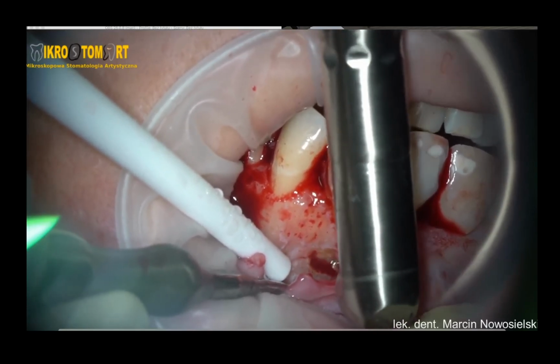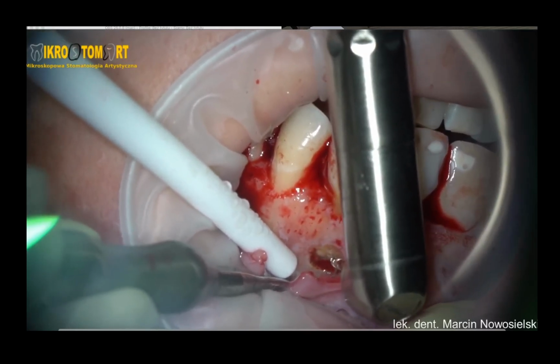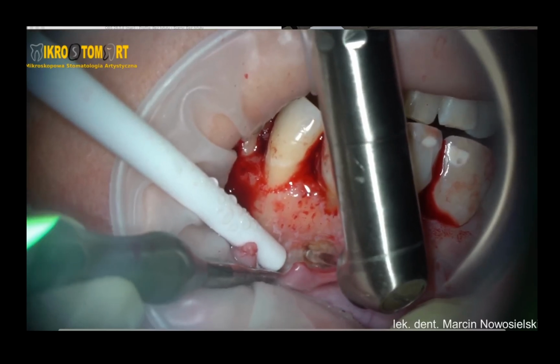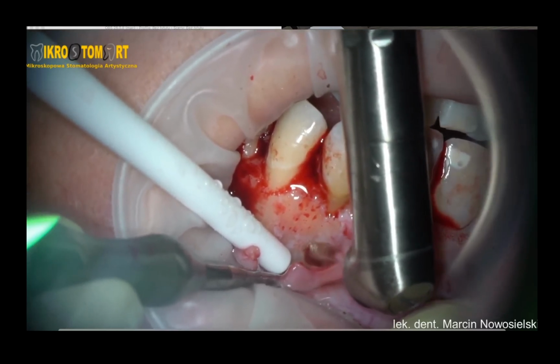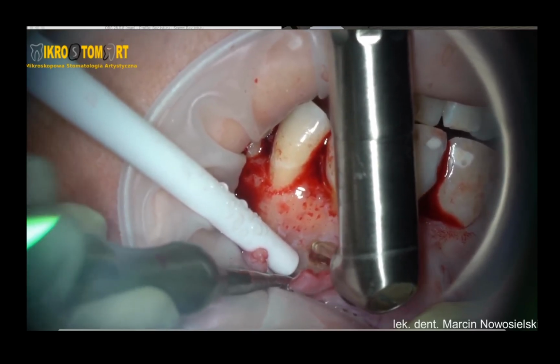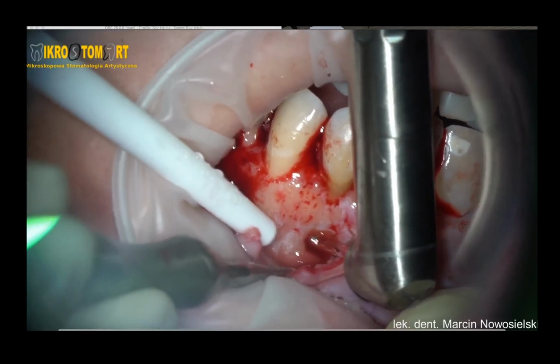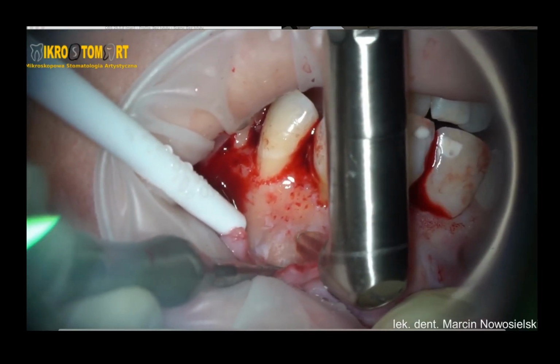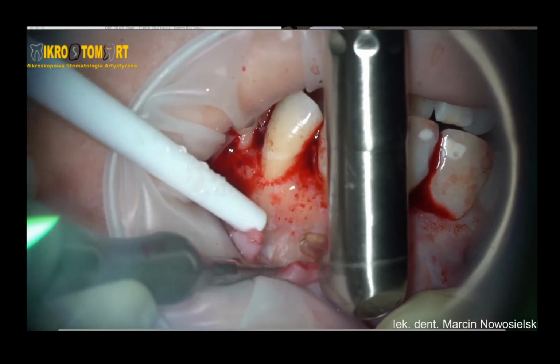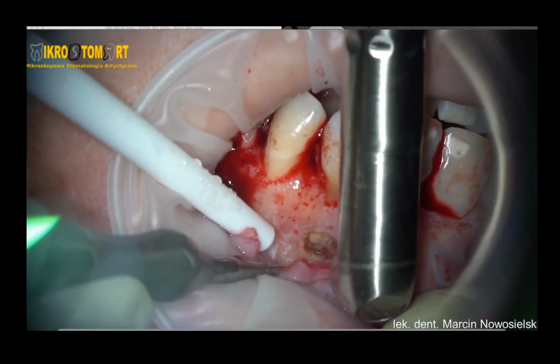All the tissues in our body consist of water, and the water which is inside this tissue, let's say, explodes, and with this explosion part of the tissue is removed, and we can very effectively proceed with our osteotomy. Effectiveness is not the most important thing here.